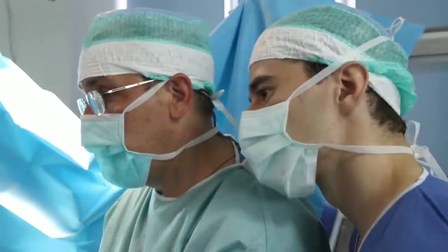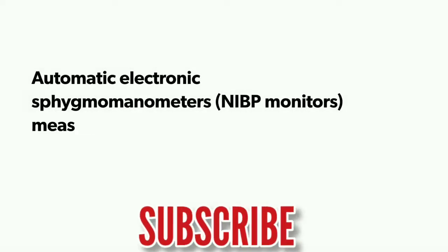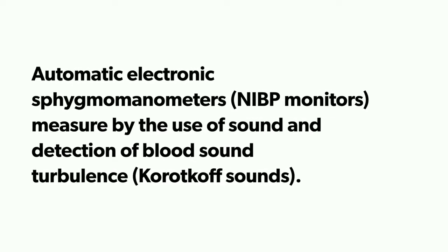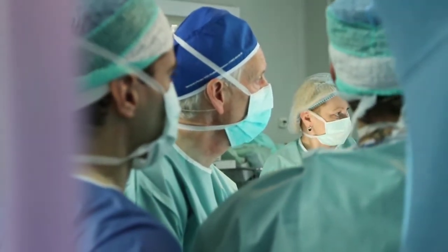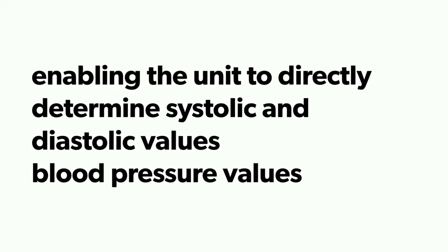So how do they operate or how do they work? Automatic electronic sphygmomanometers or NIBP monitors measure by the use of sound and the detection of blood sound turbulence, or Korotkoff sounds. A microphone positioned against an artery compressed by the device cuff detects the Korotkoff sounds, enabling the unit to directly determine the systolic and diastolic values, or the blood pressure values.